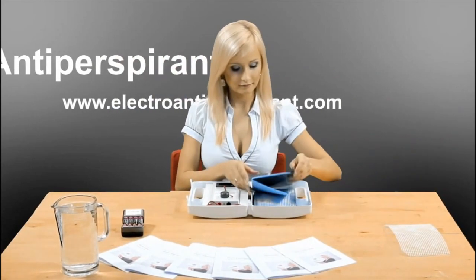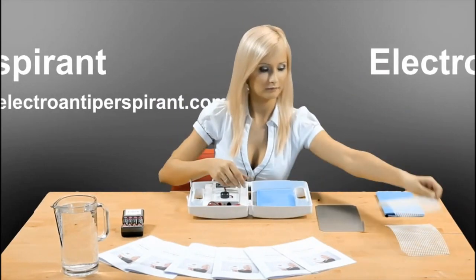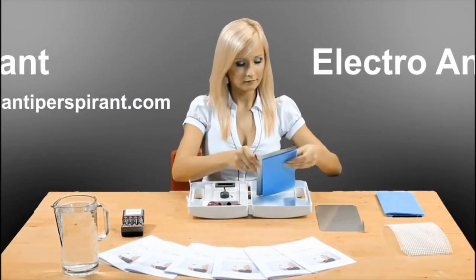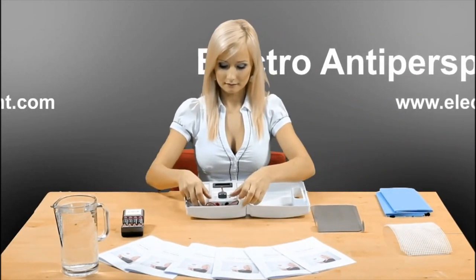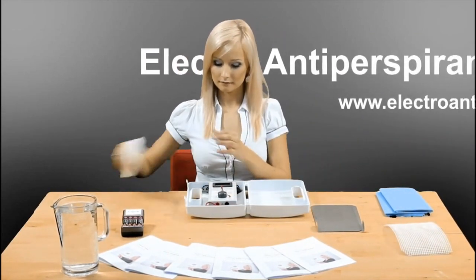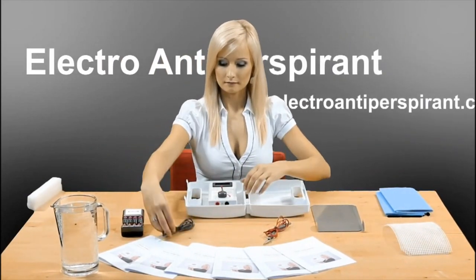Hitechdevelopment.com. In addition to the device itself, the basic package already contains all the accessories you need to carry out therapies which will prevent excessive sweating. The device and accessories are properly certified non-prescription medical devices which are currently used by reputable skin clinics and individual patients worldwide.